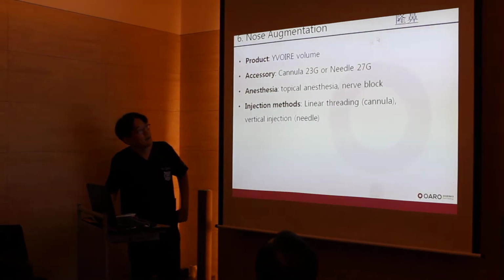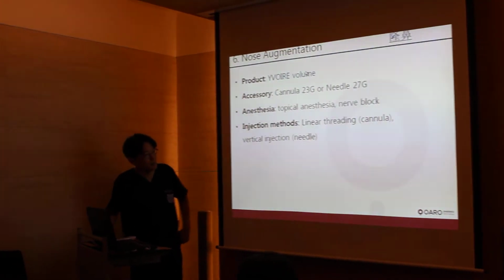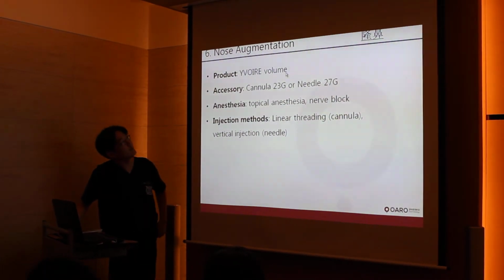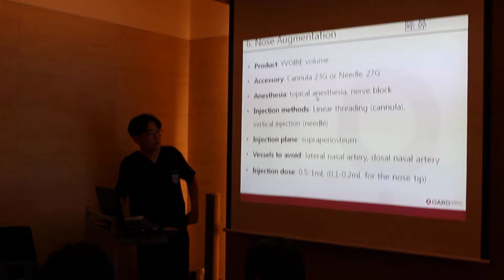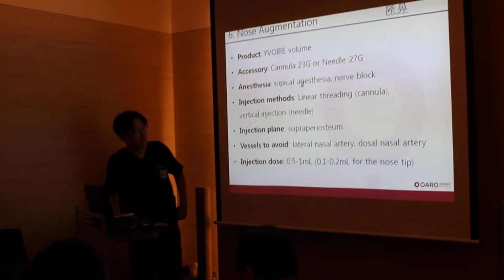Nose augmentation is also very popular in Korea because the Asian nose is sometimes very low compared to Caucasians. So injecting filler for nose augmentation is popular. But you should be a little bit careful when you inject filler in the nose because of major vessels around the nose. Sometimes vascular accident happens in this area.